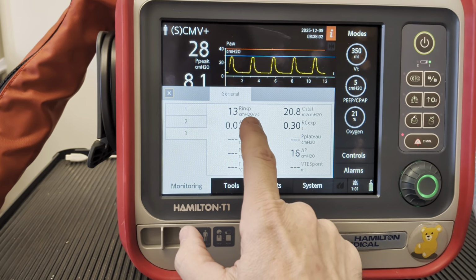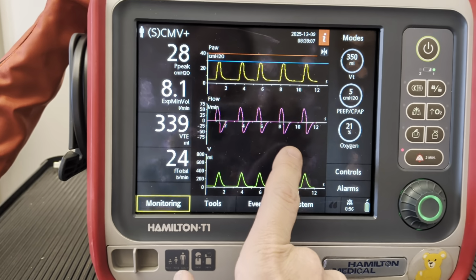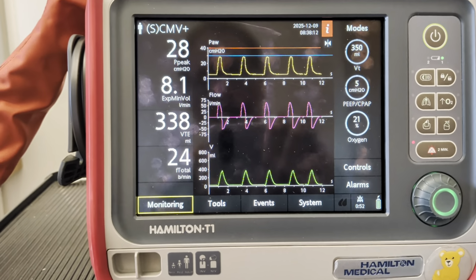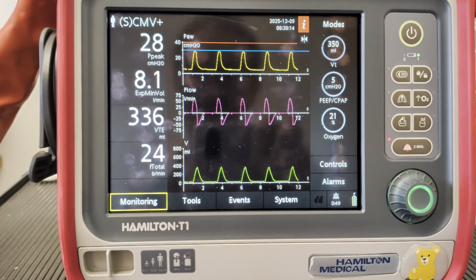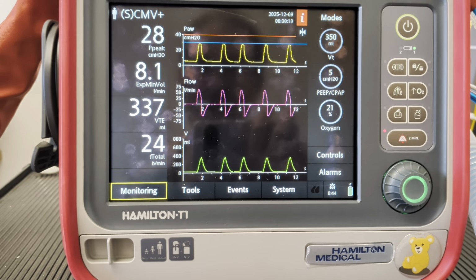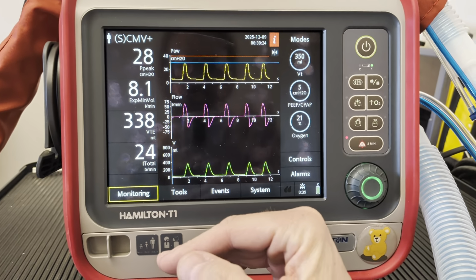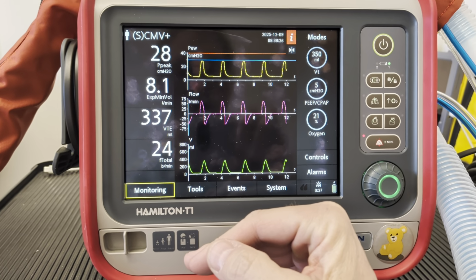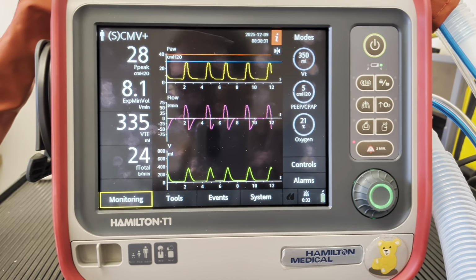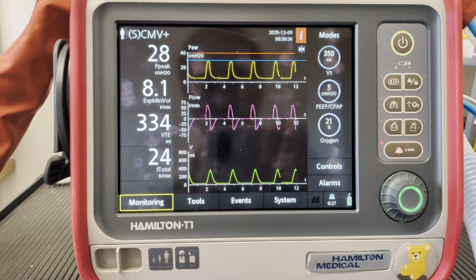So monitoring your airway resistance and monitoring the flow time scalar are going to be two things that you can do with the ventilator that can detect the presence of increased airway resistance. And of course, you're looking at trends, and then you're also taking the lung mechanics that you see on the ventilator and ensuring that they comport with the clinical examination of the patient, lung sounds, underlying history and physical exam, etc.